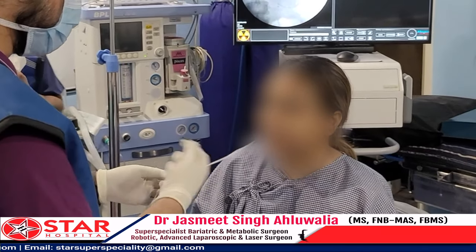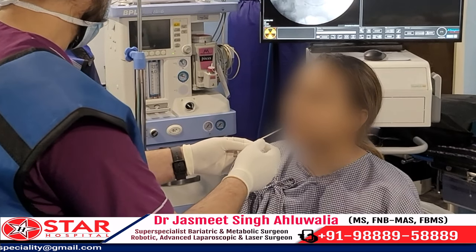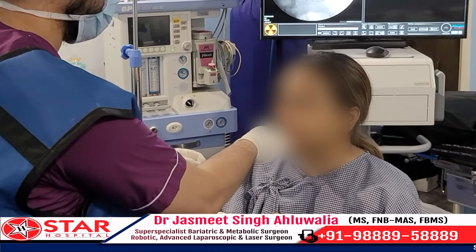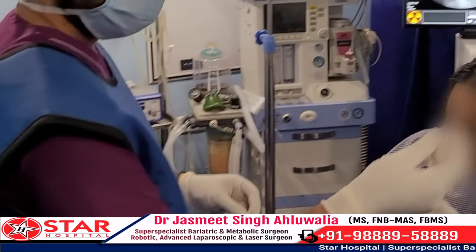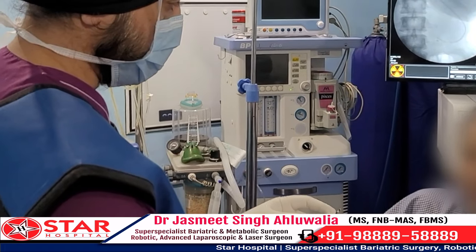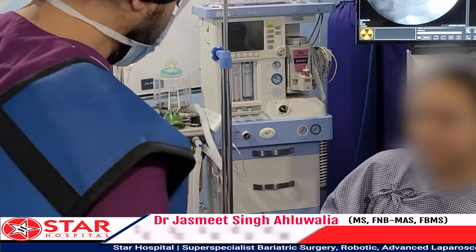We are now very quickly able to pull out the catheter. The patient is comfortable — she may have a cough for a few seconds — and then the process is complete. We check that the entire catheter has come out by looking at the markings at the tip of the catheter.